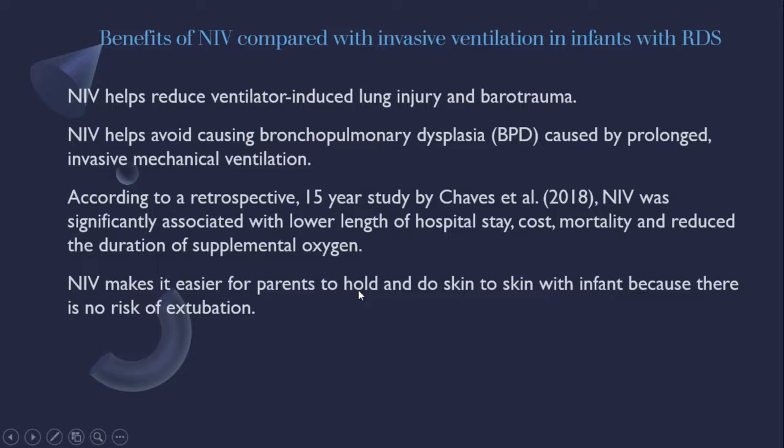We'll talk about the benefits of NIV when you compare it with invasive ventilation in infants with RDS. So NIV helps reduce ventilator-induced lung injury and barotrauma. NIV has been really instrumental in reducing BPD rates, or bronchopulmonary dysplasia. And this is caused by prolonged invasive mechanical ventilation. So if an infant's ventilated invasively long-term, those increased pressures can cause the lungs to become overdistended and fibrotic, and then you've got a chronic lung in your hands, and we don't want that.